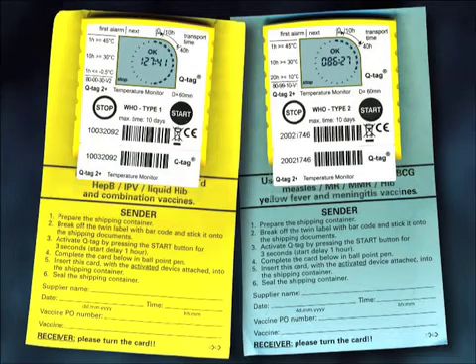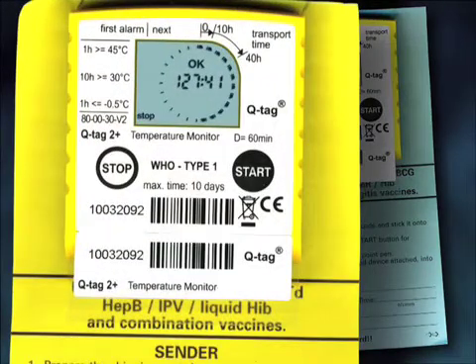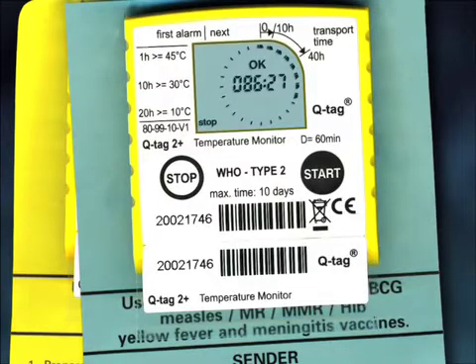There are two types of devices. The Type 1 device is attached to a yellow backing card and is designed to accompany the DTP, DT, TT, hepatitis B, IPV, liquid Hib, and combination vaccines.